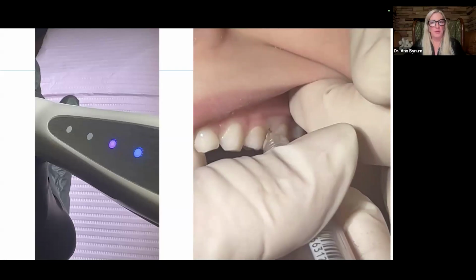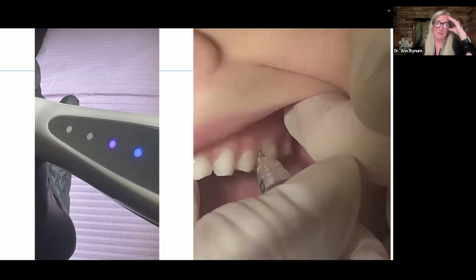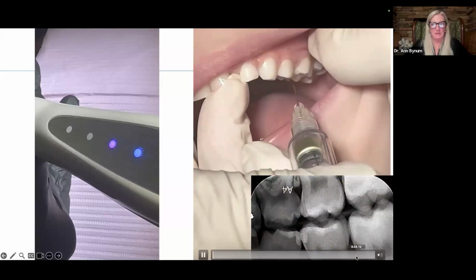And you can see, I hope you can appreciate, one of the things we always hear is you want more videos. I mean, we're master clinicians, but we're not master iPhone people. That's obvious. But what we want you to appreciate is the different angles, right? When we're doing stage 1, that's a completely different angle and goal with that needle than what we're doing in stage 2 and stage 3. And I think you can appreciate that.